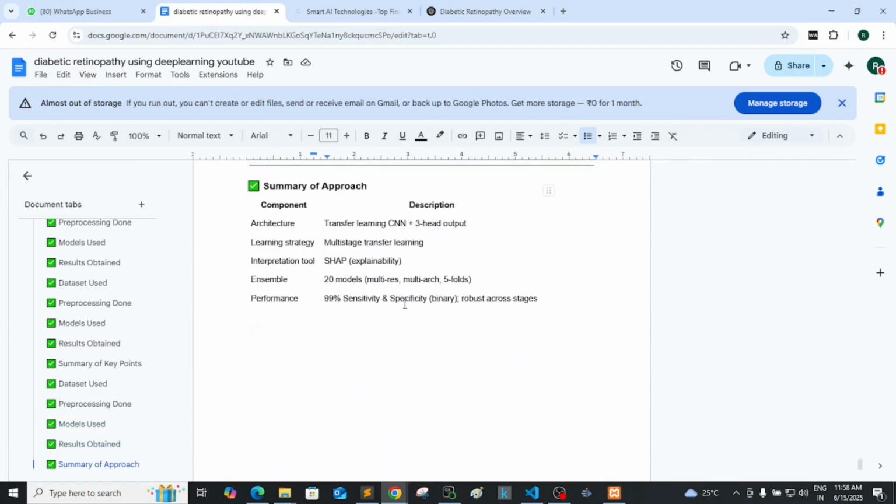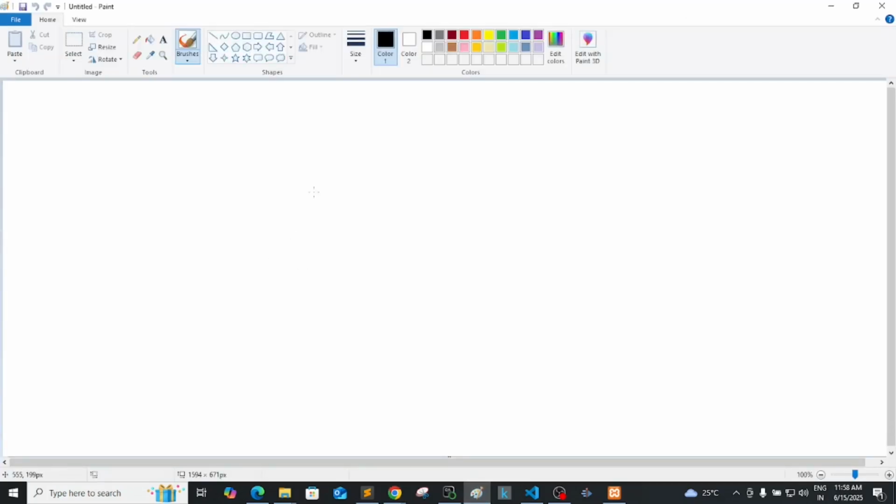Now let us propose our own methodology which is better than the existing. I will tell you what extra we will be doing. Under pre-processing, these papers are not concentrating much. If they are, they use only noise removal functions, but just removing noise is not the important thing here. You need to have a better vision, and make sure your data is much easier for our models to understand, which leads to better accuracy. You can't use one filter and leave it.